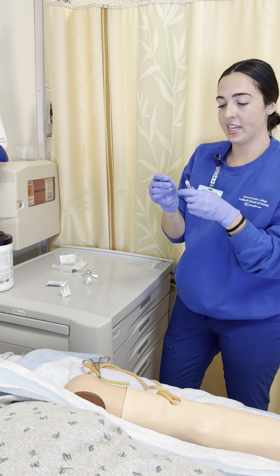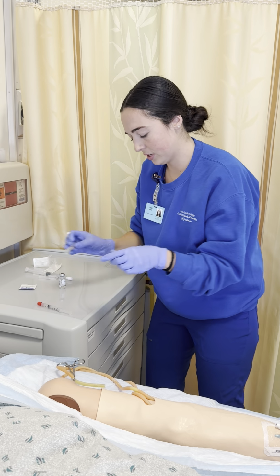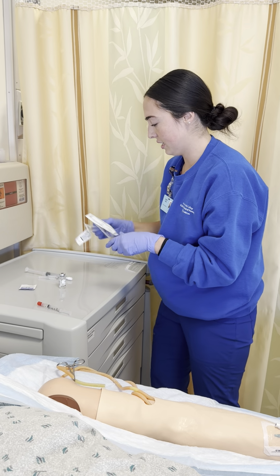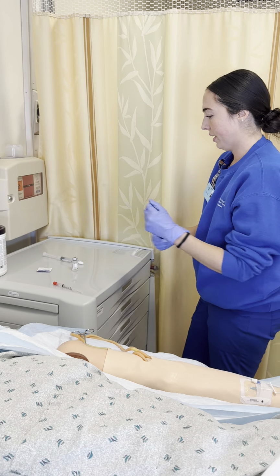So my second med check is now complete. I've made sure that everything looks good, and I'm going to get rid of any trash that I do not need anymore.